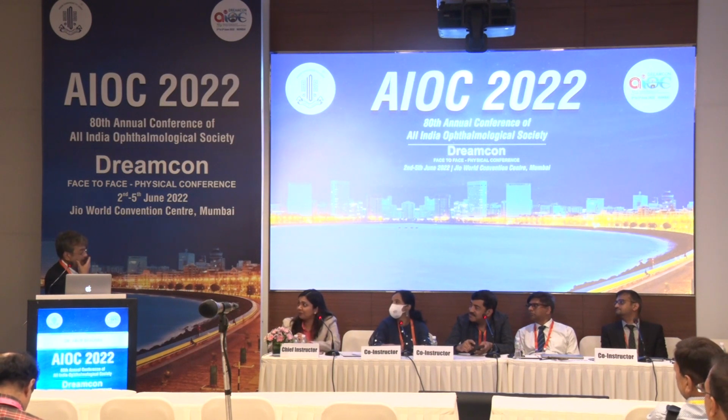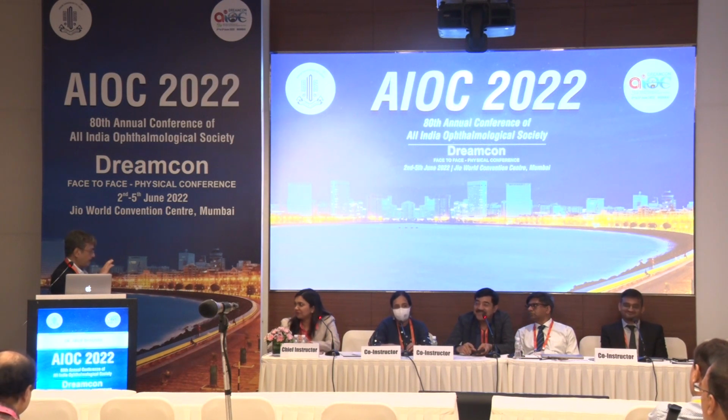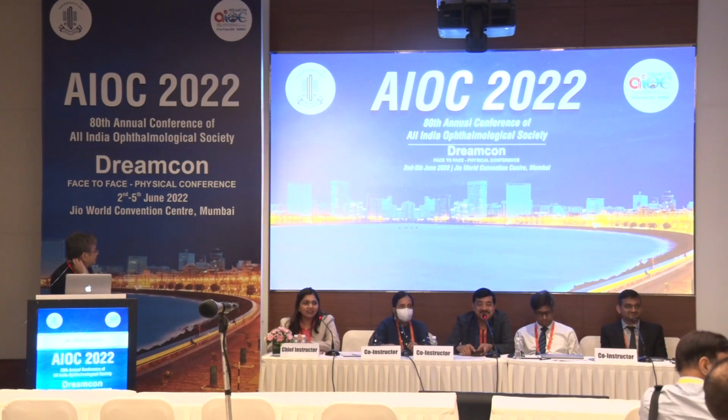On repeat calculation, if your IOL has been changed, do you have to go for it? That depends on the patient, how demanding the patient is, and how much my commitment is towards the patient. Yes, most of the time, as Shagor shows in the formula, there are multiple steps where we can pick up the wrong lens. But even 0.5 or 0.75 doesn't matter. Our patients are forgiving, and don't complain so much. In that case, we just avoid doing the rotation.